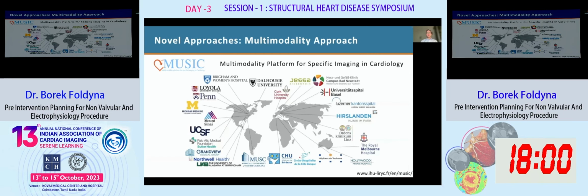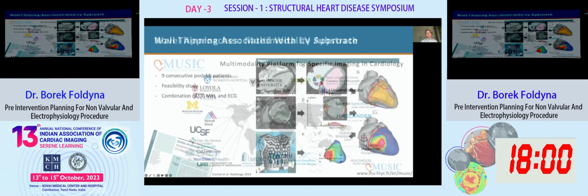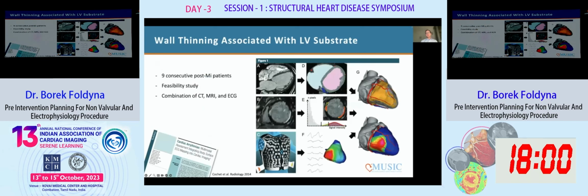There are also multiple multimodality approaches. For example, the MUSIC study is one of the most famous ones. Multiple hospitals are working or were working on this concept, including the hospitals where I used to work in Germany. And what you can see here, they are trying to connect the CT imaging, the MR imaging, but also the EKG to map the substrate. And this is just a feasibility study already from 2014, and this concept is still being worked on. So there is still a lot coming our way.